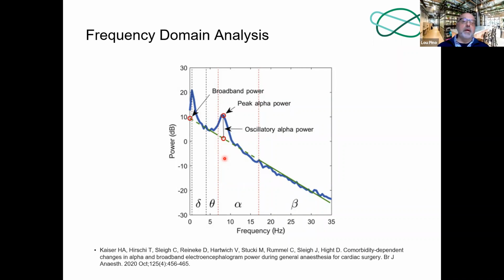So an easy experiment with alpha waves is to measure a person's visual processing center, which is located at the occipital lobe, at the back of the head, about here. When a person's eyes are open, the alpha peak is very weak at the occipital. This is because there's a lot of unsynchronized activity happening while the occipital processes complex information of the visual field, because the occipital is the center where our visual processing happens.